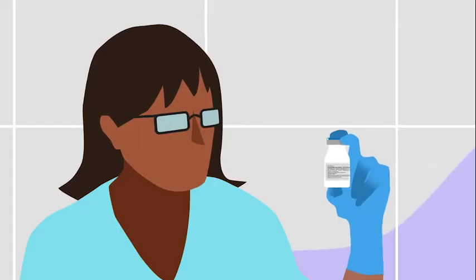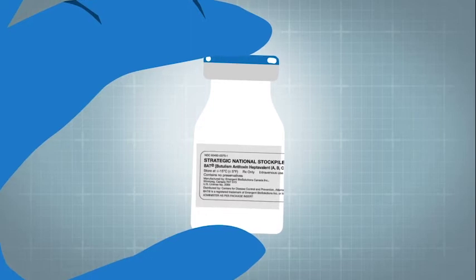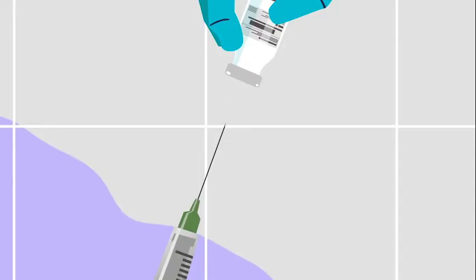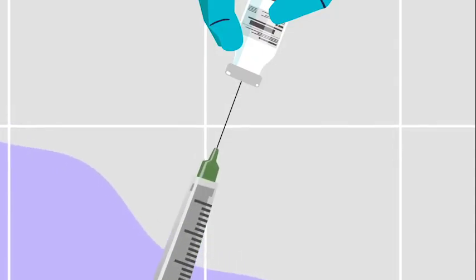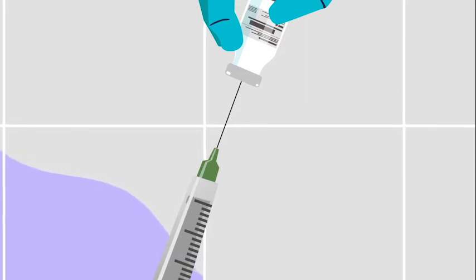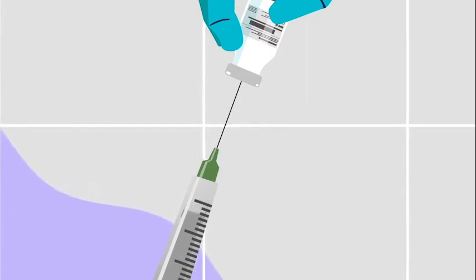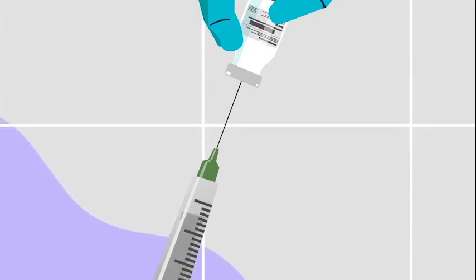The volume in the vial varies by lot number. Vials typically contain 10 to 22 milliliters. Withdraw the entire contents of the vial to measure the volume so you can accurately calculate the amount needed and the 1 to 10 dilution. The antitoxin bottle is submerged in a water bath and then held by a blue-gloved hand. A syringe is inserted into the bottle of antitoxin.